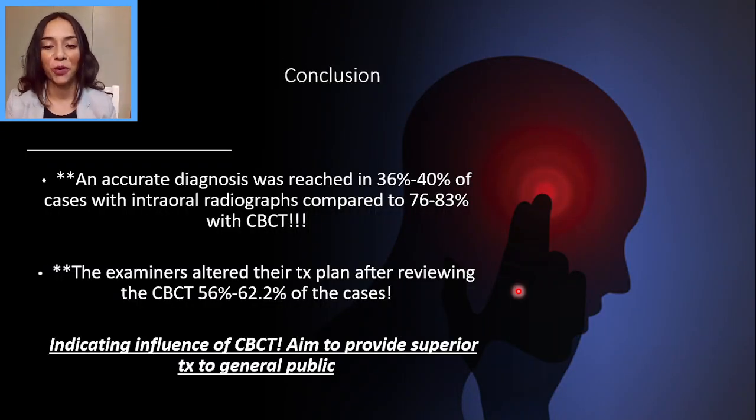All right, conclusion. What I want you guys to take away is I'm a huge fan of CBCTs, especially after creating this presentation, because I think it is such a useful tool in both endodontics and in different fields of dentistry as well. And obviously, as healthcare providers, our goal is to improve and provide superior treatment to the general public and to our patients, and hopefully a CBCT is used appropriately and in hopes to improve prognosis, and can be used throughout the treatment planning phases, during diagnosis, between appointments, during complications, for follow-up. It's such a useful tool.